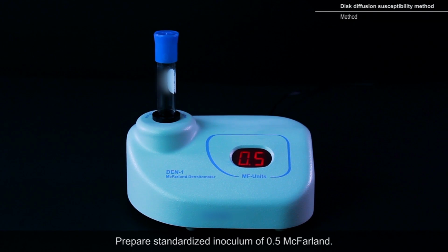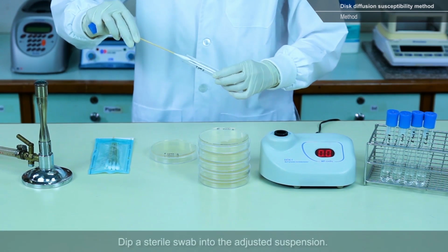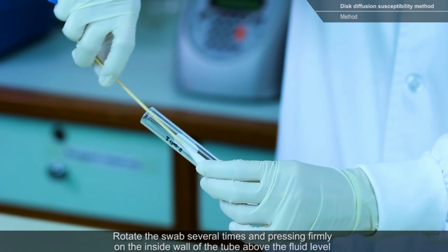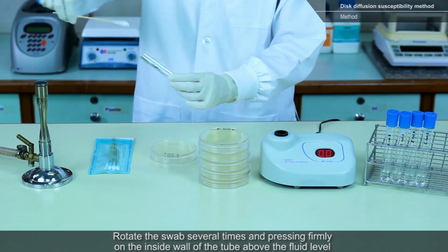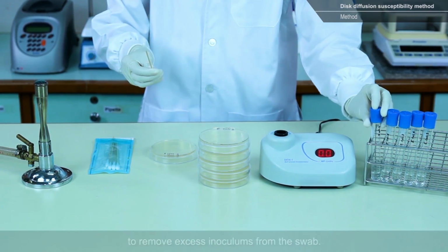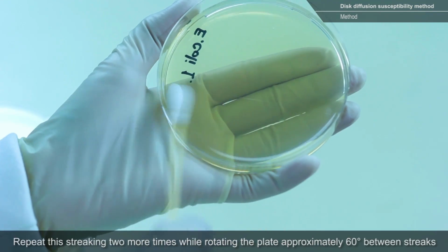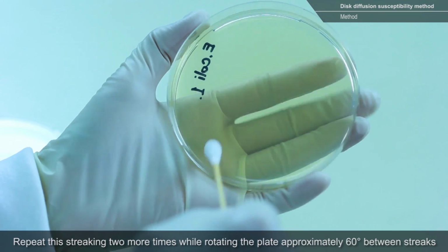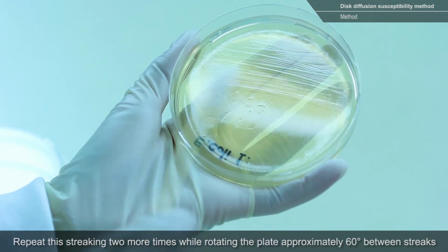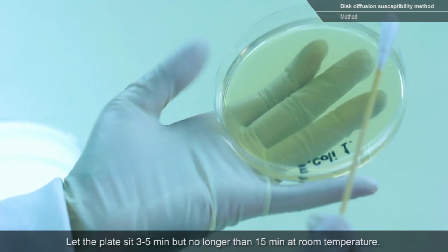Prepare standardized inoculum of 0.5 McFarland. Dip a sterile swab into the adjusted suspension. Rotate the swab several times, pressing firmly on the inside wall of the tube above the fluid level to remove excess inoculum from the swab. Streak the swab on the dry surface of the MHA. Repeat this streaking 2 more times while rotating the plate approximately 60 degrees between streaks. Let the plate sit 3 to 5 minutes, but no longer than 15 minutes at room temperature.